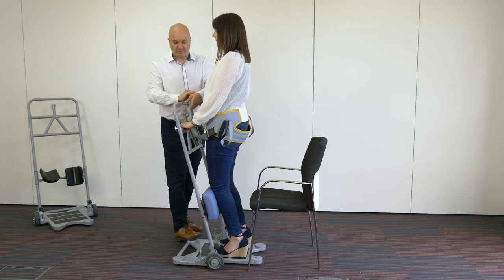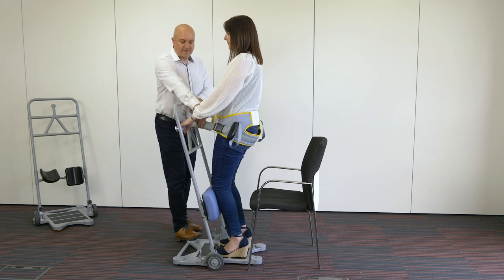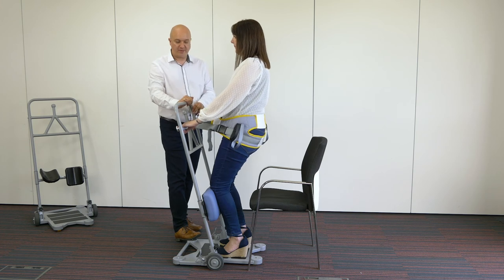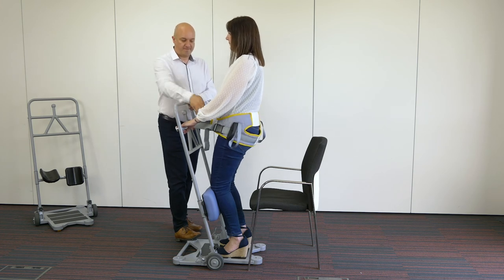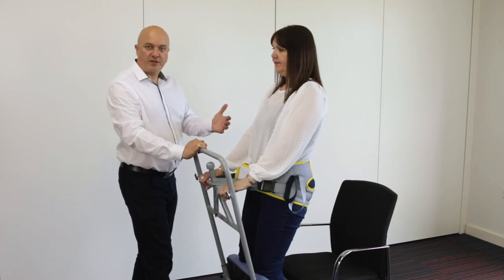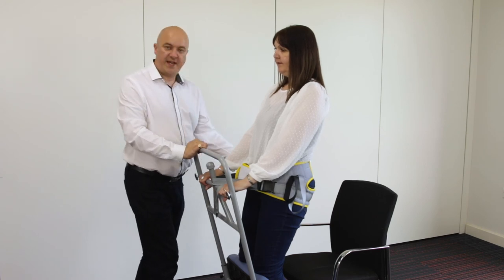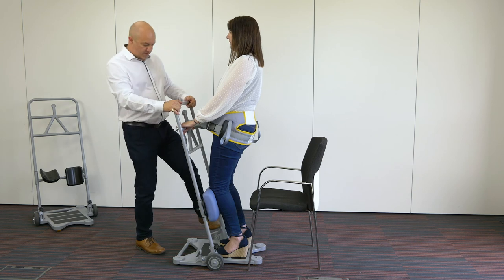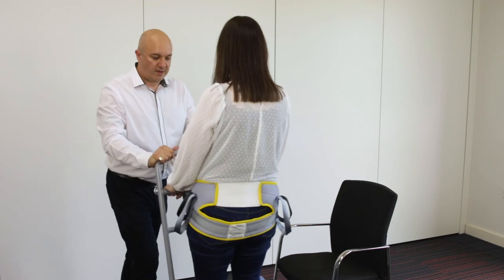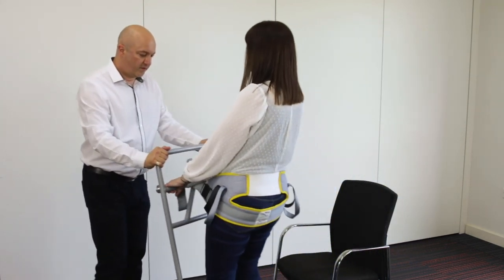As soon as she's stood, this belt goes over the centrepiece and I can pull it to adjust the amount of support. You can literally just sit on that belt. If I pull it tighter — she's held in position; she can't fall regardless. You have the feet on the base, the knees blocked, and the hips held in position by the belt. This one is designed for transporting — if going a further distance we can use it whilst transporting from A to B.